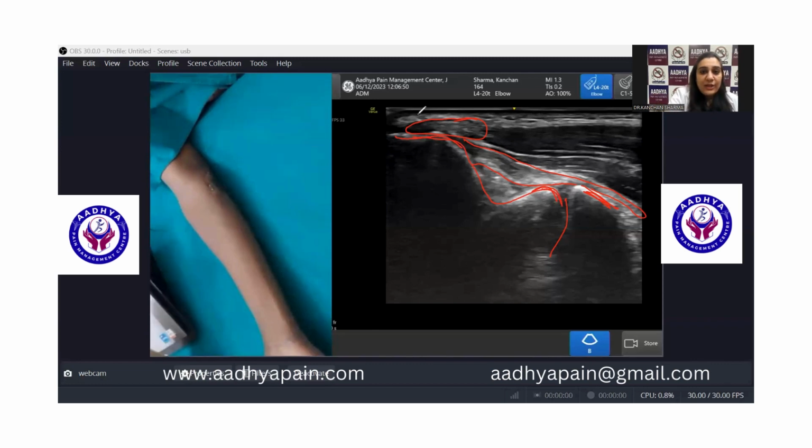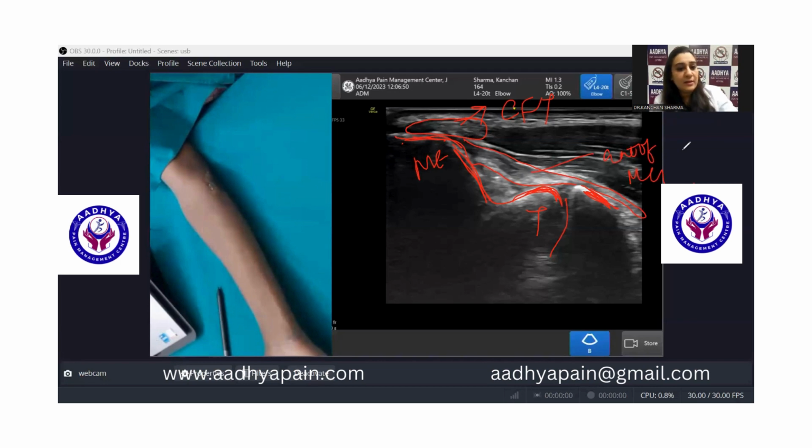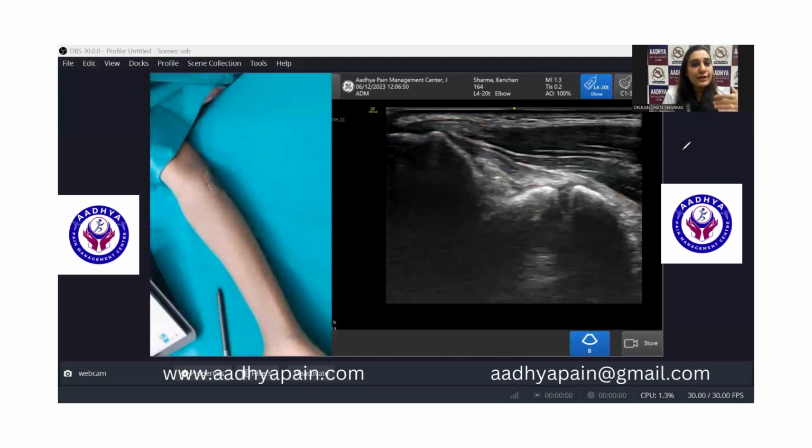Before going into that, we are just repeating it. That was the tendinous portion of the common flexor tendon. That is your medial epicondyle. This is the downward slope of the medial epicondyle. That is your trochlea. That is the sublime tubercle of the ulna. This is your anterior band of the medial collateral ligament. Now let us see what difference we will bring in if we rotate the caudal end of our probe towards the index finger.